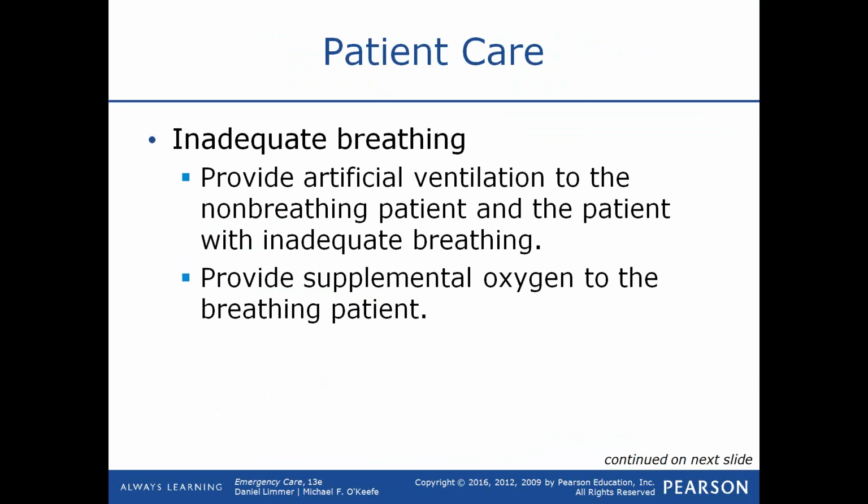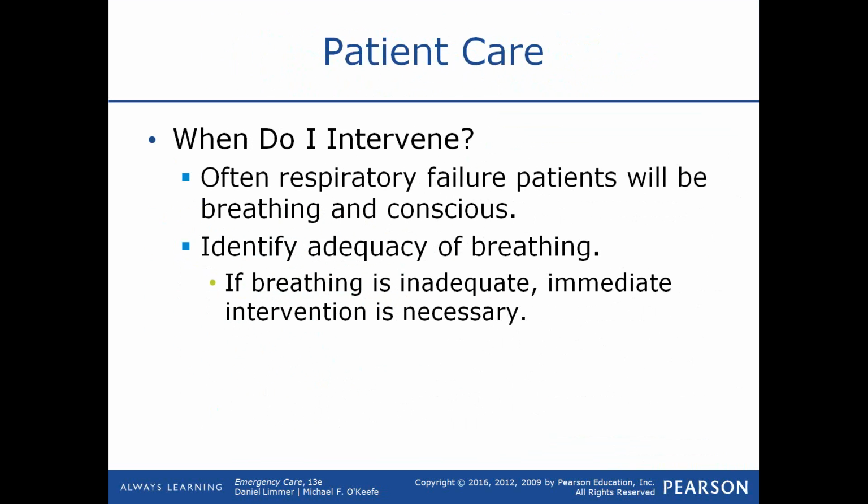When a person has inadequate breathing and we identify that, we have to restore normal ventilations. So we have to provide artificial ventilations to the patient. It's easier to do it if the patient isn't breathing at all, but if they are breathing somewhat and that breathing is inadequate, it's a challenge to ventilate your patients. You have to time the squeezing of the bag with them taking a breath in. By using a bag valve mask, we're able to supply supplemental oxygen to the breathing patient and increase their oxygen content. So I guess the question is, when do I start bagging a patient?